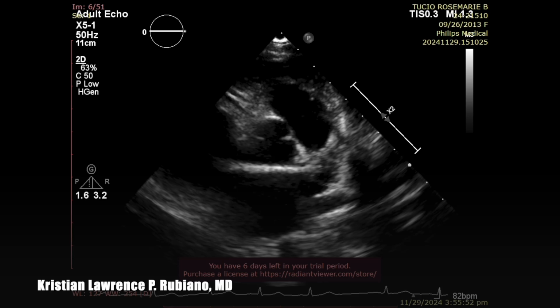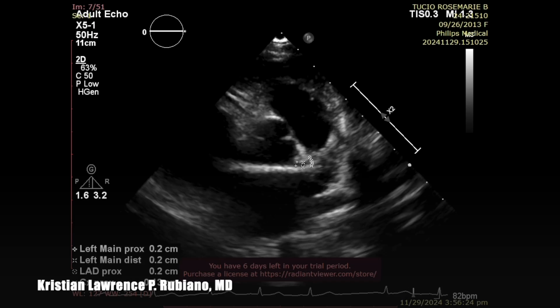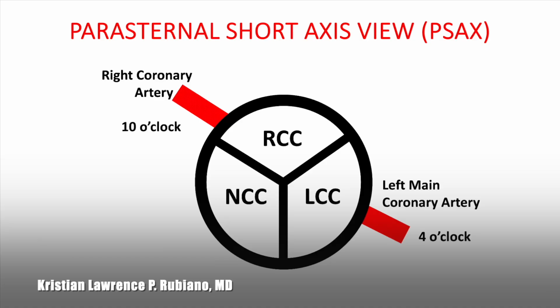Measure and identify the coronary arteries seen as to the right proximal and distal coronary arteries and left main coronary artery, left anterior descending coronary artery, and left circumflex. Important to determine the Z-scores, especially in Kawasaki patients, as well as in those considering aneurysmal dilatation of the coronary arteries.